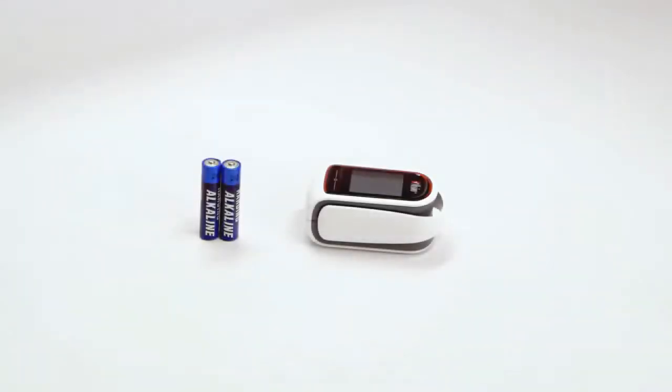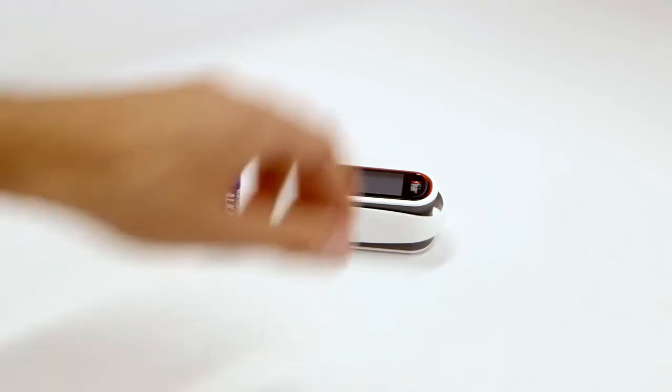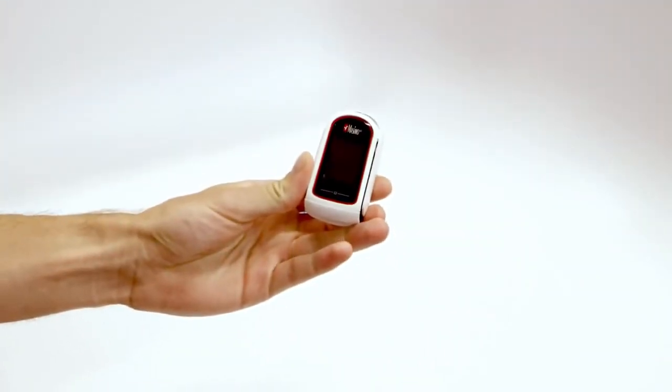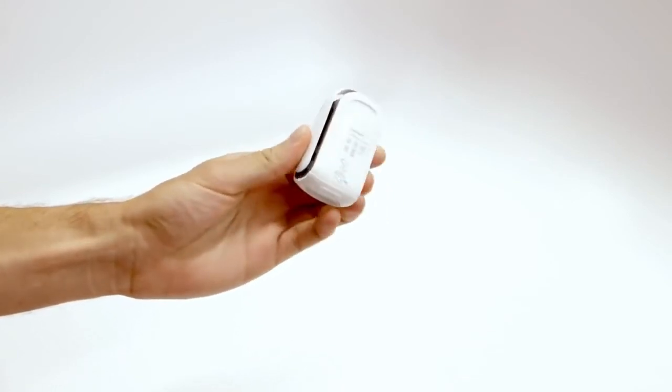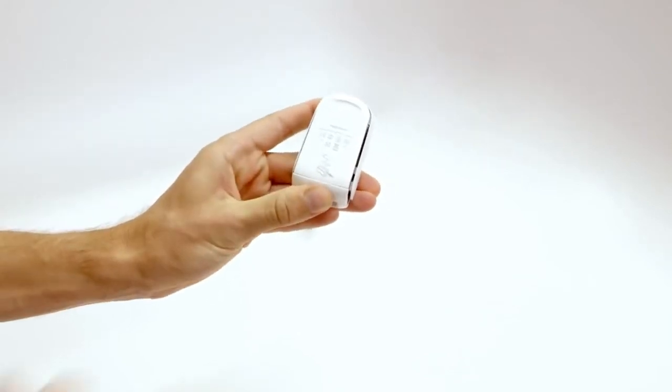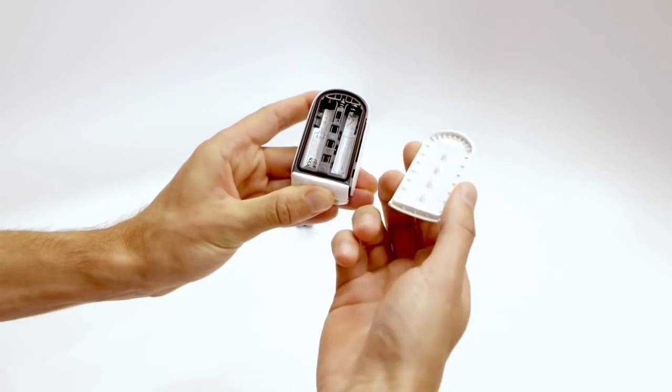Battery installation: The MightySatRx requires two alkaline batteries to operate. Orient the MightySatRx so that the display screen is facing downwards. Locate the battery button on the front of the sensor pad. Push lightly on the battery button to release the battery cover and then remove it.